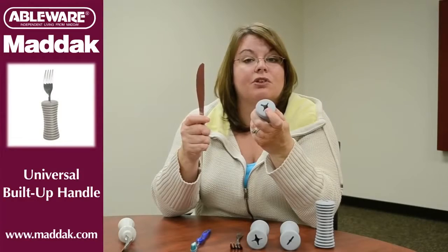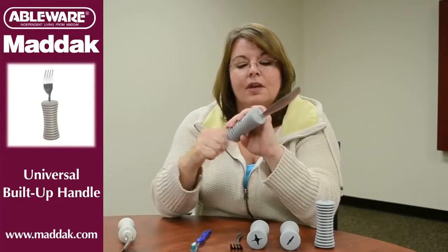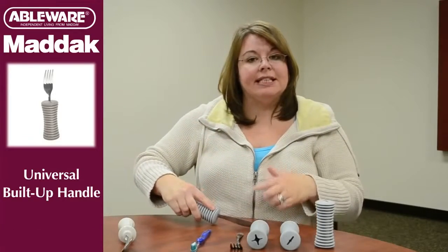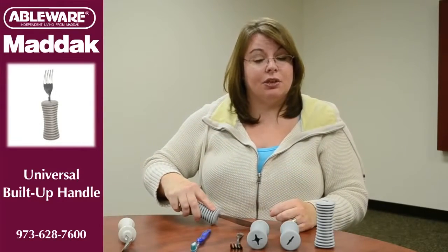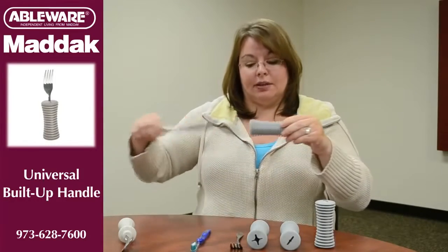We recommend it for use with a butter knife only. Again, you start with the star-shaped end and slide the handle through. The first time you use it, it's going to seat itself and stay that way until you're done. To take the knife out, you just slide it back through the handle.